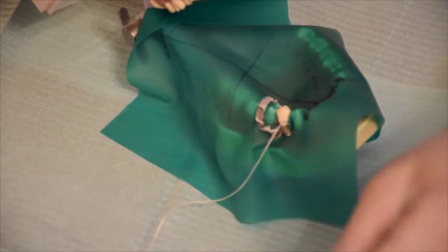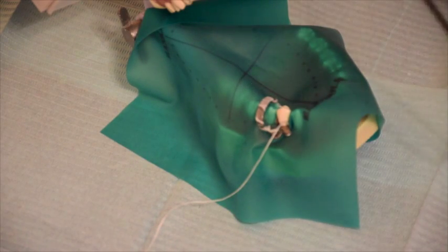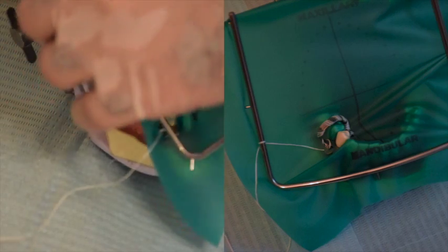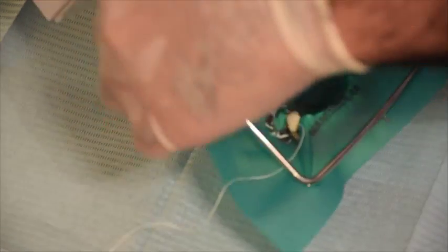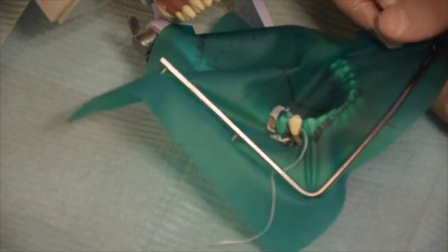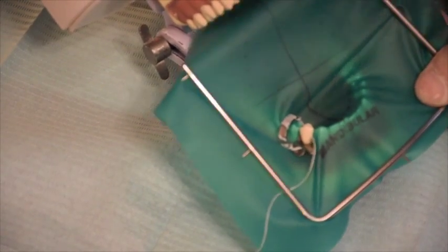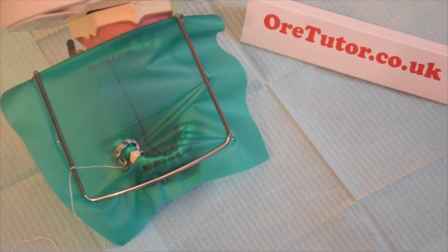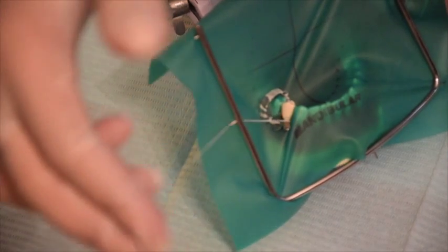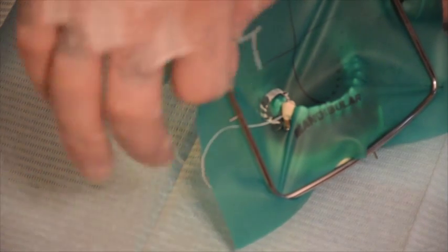Now place the frame — it has an arc shape, and the arc should follow the chin of the patient. Stretch and secure the rubber dam onto the pins of the frame. Remember that in real life you should cut or bend this part so the patient can breathe normally. You can also secure the dental floss to the frame by rolling it over the frame once.